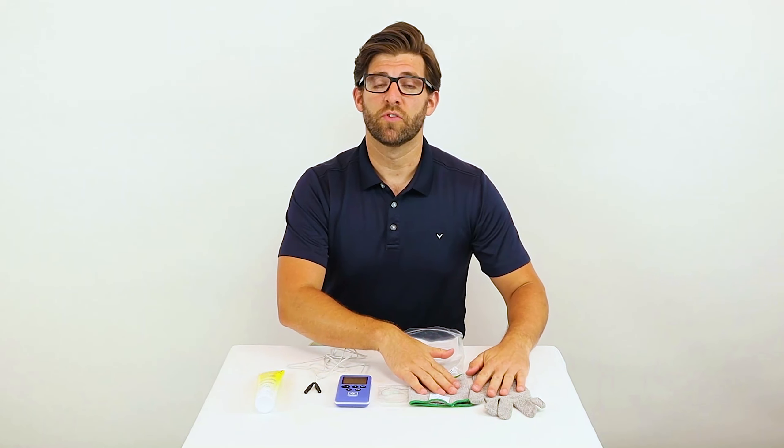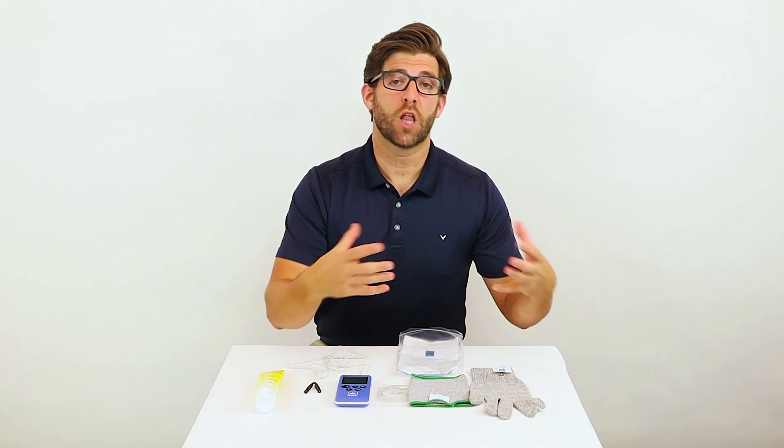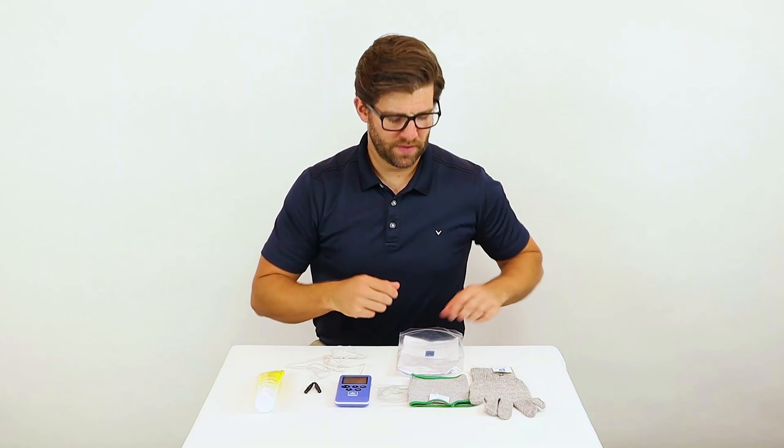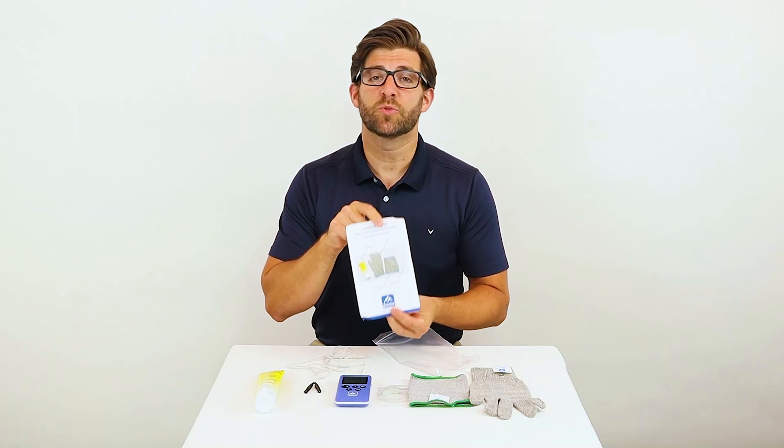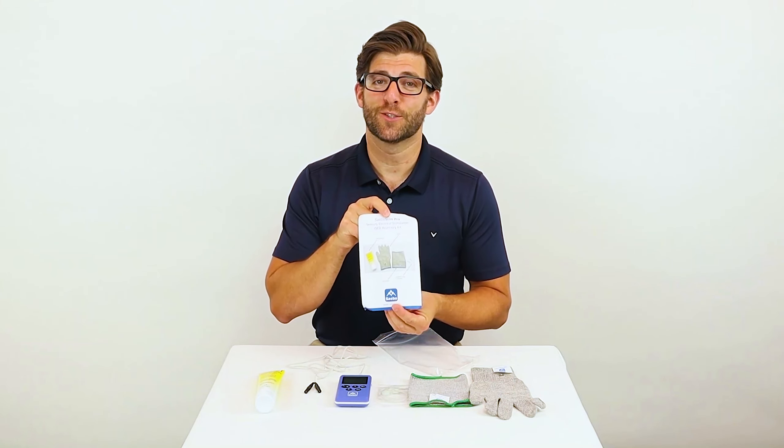Next you will find an elbow sleeve and a glove. Both of these have silver woven through them to make them one large electrode. And last but not least, you have an instruction pamphlet. Please read this as it helps with how to use your accessory kit.